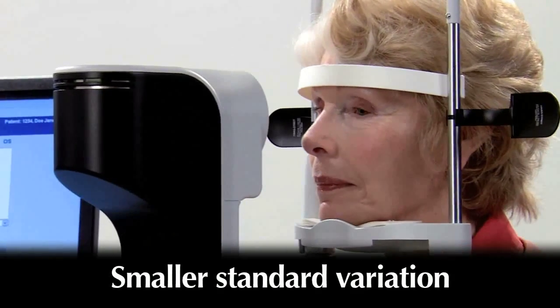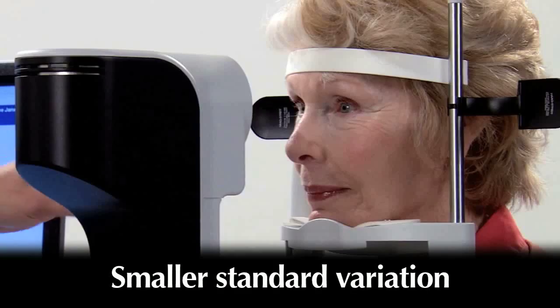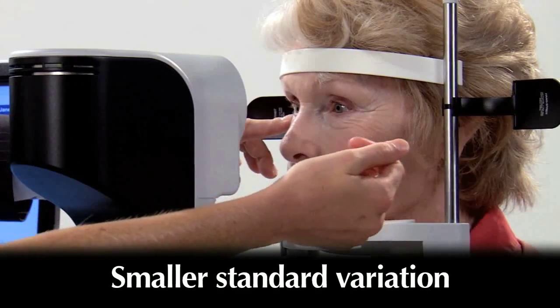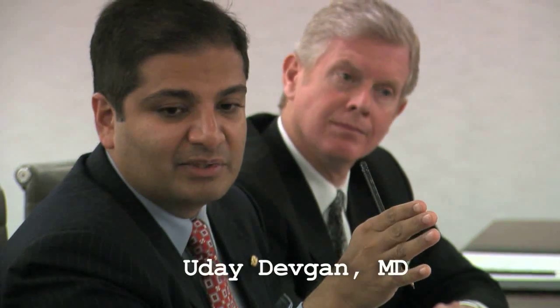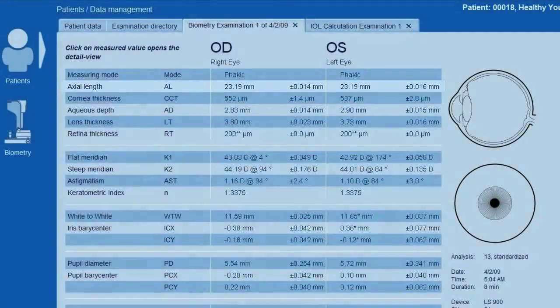The myopic eyes tend to be the most forgiving in terms of variances in axial length measurements. Clinical data also shows that the standard variation is smaller with optical biometry compared to A-scan ultrasound. One thing nice with this machine is that you are essentially foveating on the measurement every time, so you're sure that you're measuring the axial length through the fovea.